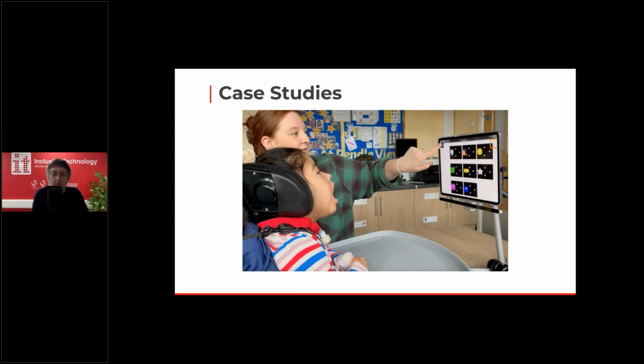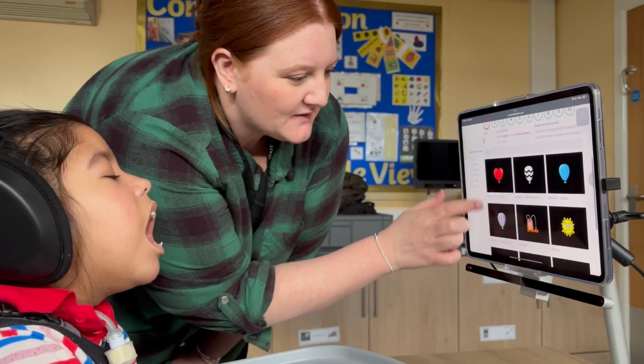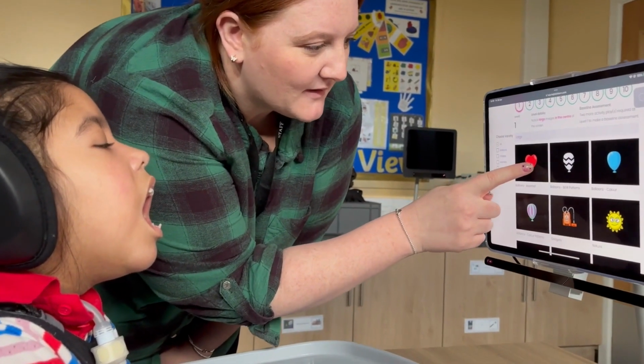So I've got some videos here showing them using them. First of all, we're going to be looking at Husna, who's aged 8. She's going to be demonstrating Eyetuitive for us now on the video. Husna has a wide range of complex needs.